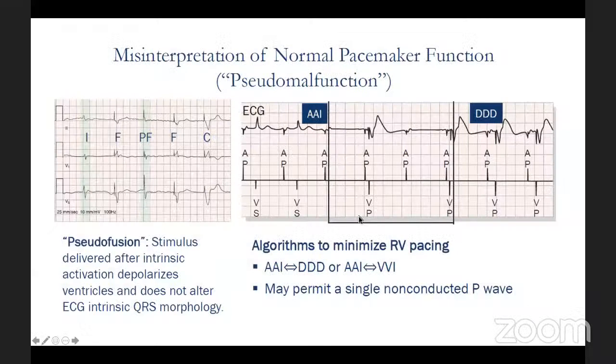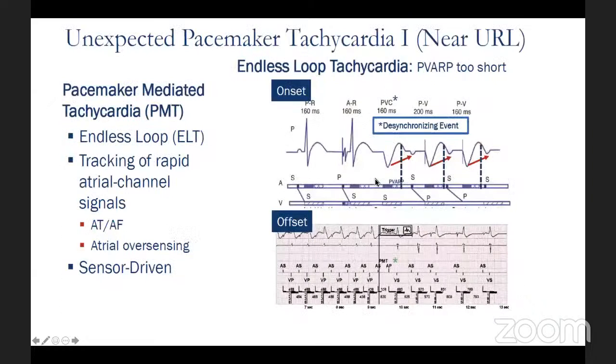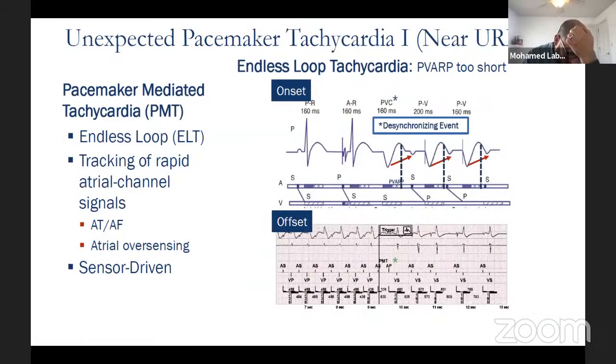The second question is about the magnet with PMT, pacemaker mediated tachycardia. Is there any role for magnet in those cases? You know, especially with limited resources, if the interrogation is not available, is there any role for magnet on those patients? Yes. Thank you. This is the easy solution of this problem.